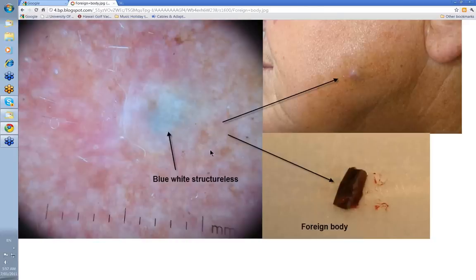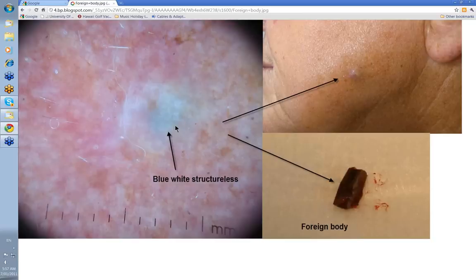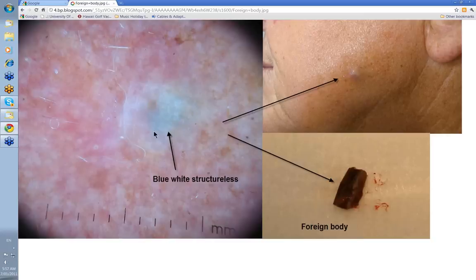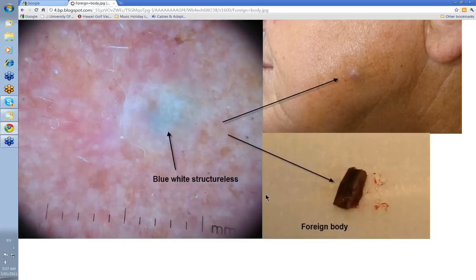Lastly, another cause of blue-grey or blue-white structureless. Looking at this cyst-like lesion on the face, which feels firm, you might think it's a trichoepithelioma or a pilomatrixoma — and that would probably be my first thought. But remember: blue-grey or blue-white structureless can be melanoma, melanoma metastasis, BCC, haemangioma, old haemorrhage, and foreign bodies. And this was the foreign body that came out of this lesion. So just remember foreign body as a cause of blue-grey or blue-white structureless.